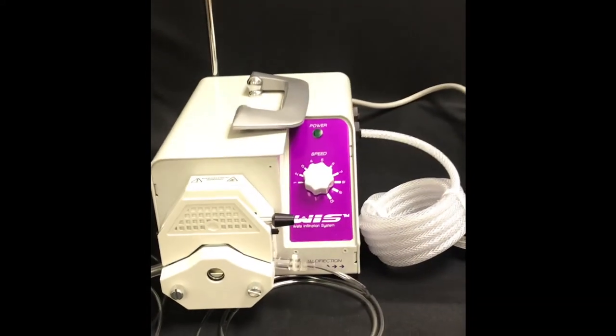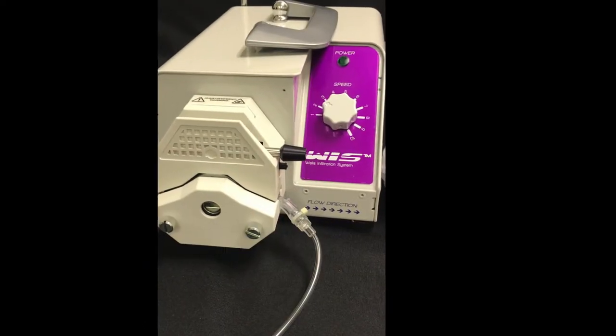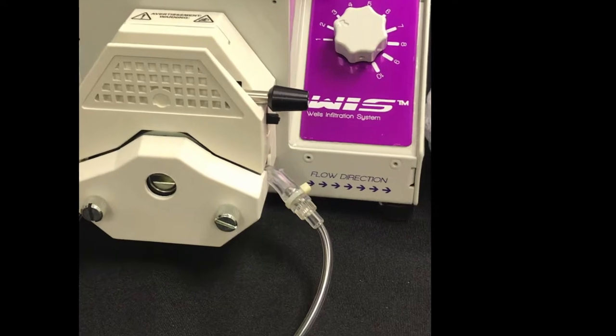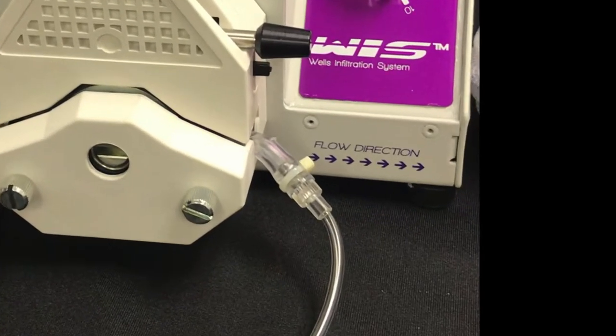Rotate the pump head lever clockwise to close the pump head and clamp the tubing. The flow direction arrow on the infusion system indicates how the tubing should be inserted into the unit.